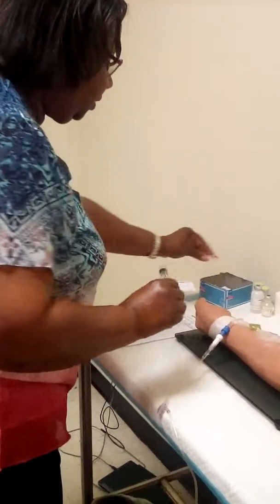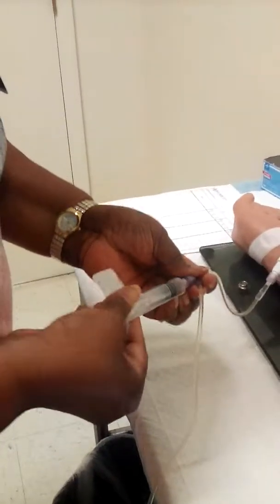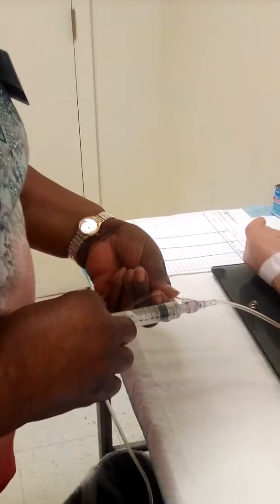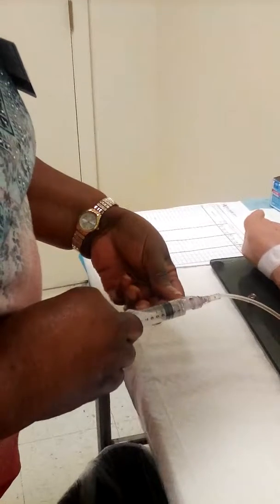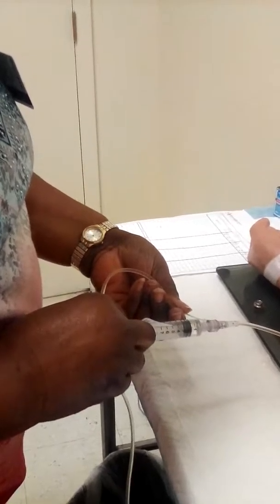Discard my needle in the sharps container. Connect my syringe to the port. I'm gonna give 0.2 milliliters over a minute, for a total of 5 minutes. I'm gonna push and pause.